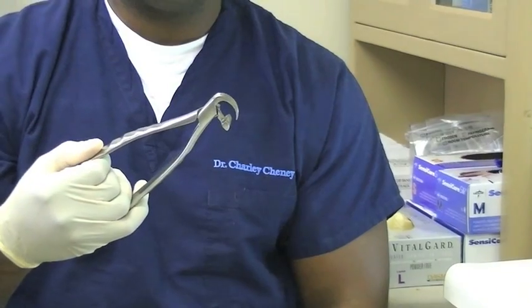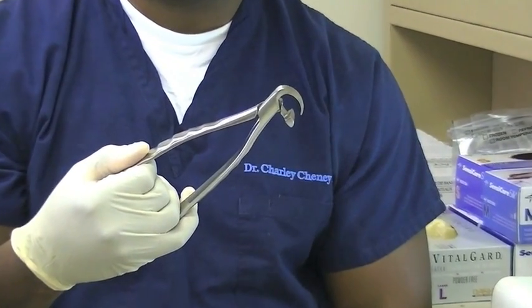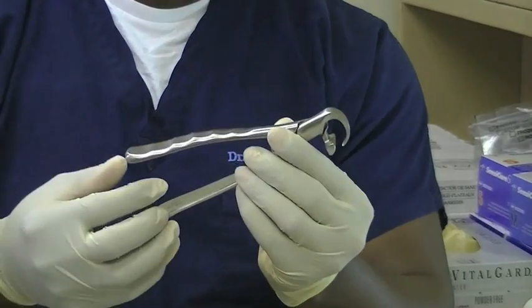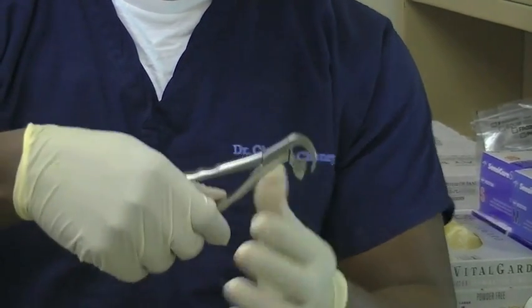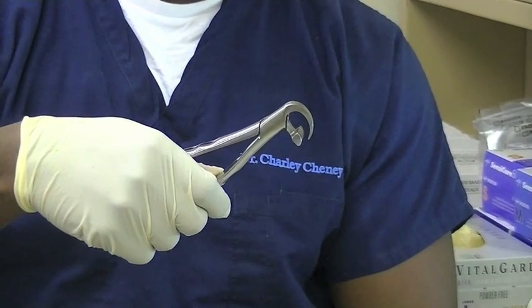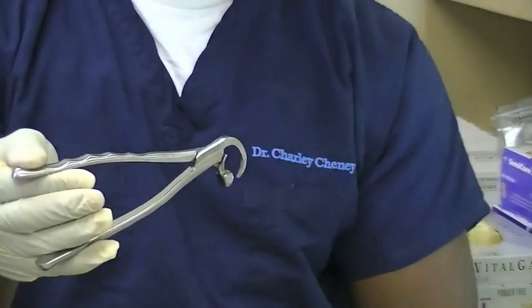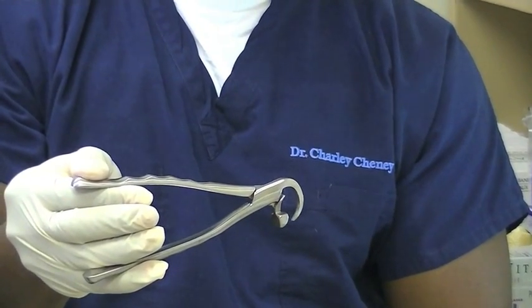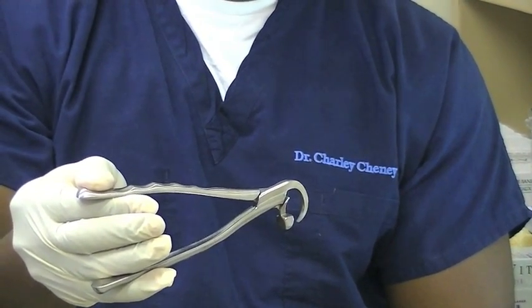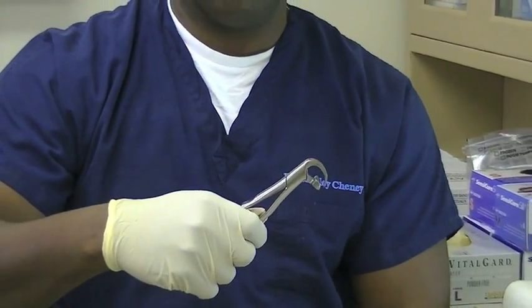The difference between using conventional forceps and the physics forceps is the handling of the handles. You're not grasping the handles, clamping down on the forceps. Instead, you're just engaging it and rotating your wrist. The energy comes from the rotation of the wrist and not clamping down on the forceps.